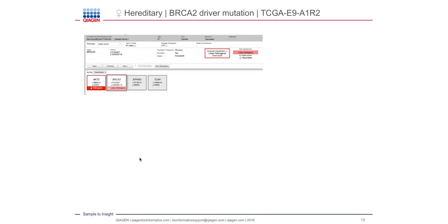in the opposite, all the other cases that we've seen so far were pathogenic. In this particular case, the BRCA2 variant, based on the ACMG guideline, the information that is available in the knowledge base based on the different ACMG rules doesn't call this variant pathogenic for breast cancer, but calls it likely pathogenic. So it's still a variant that is of interest to report out.